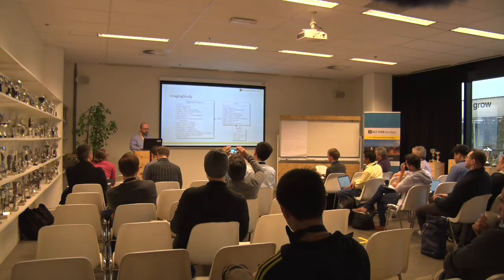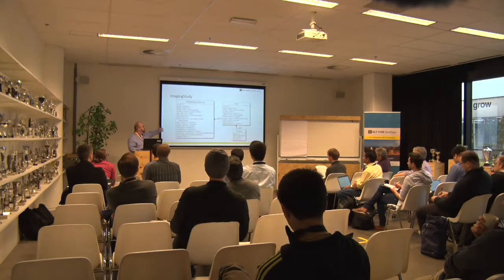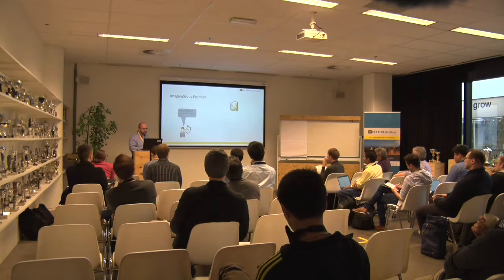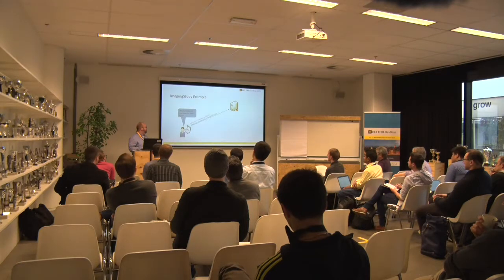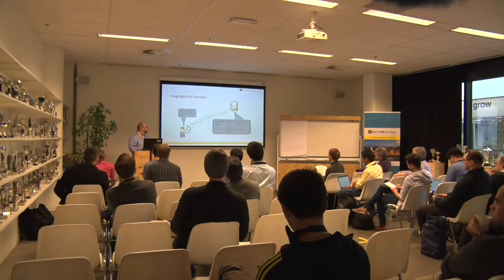So imaging study looks a lot like this. If you look at the FHIR spec, there's one main object, which is the imaging study, and then it comprises series like I showed, and then each of those series has instances. Very simply, if I were to do a query using FHIR, I would just pass along something that looks like that. What studies do you have for John Doe? And then I get back a response of the studies that are available for him.